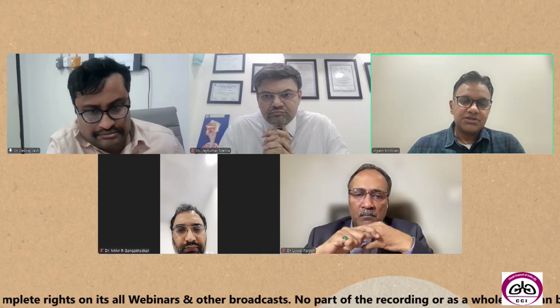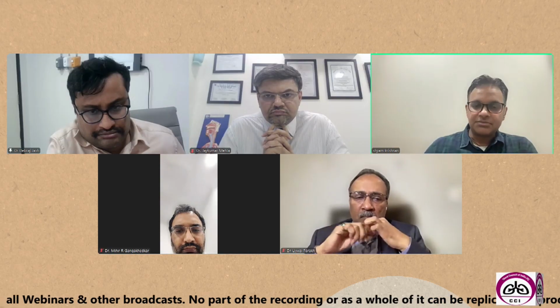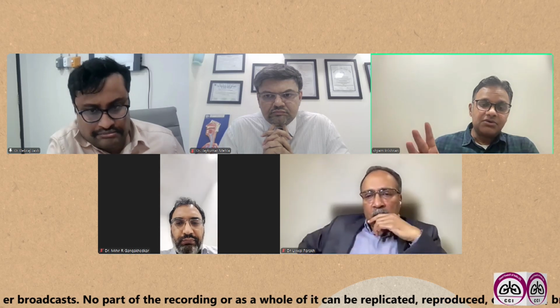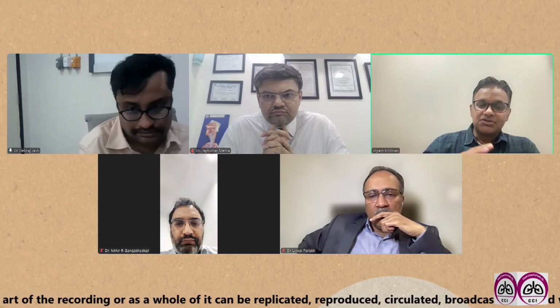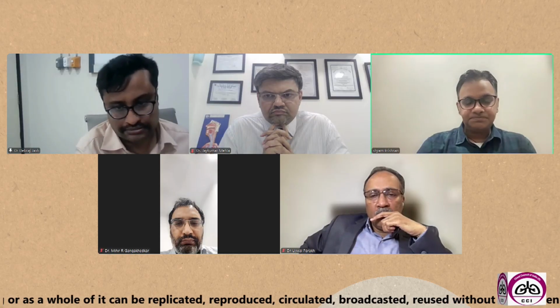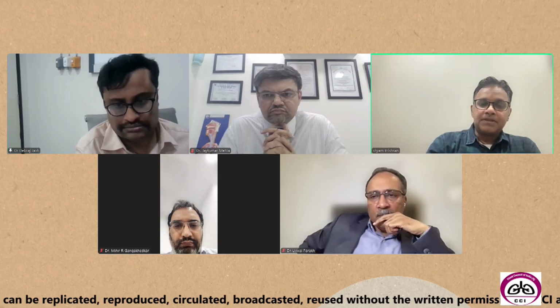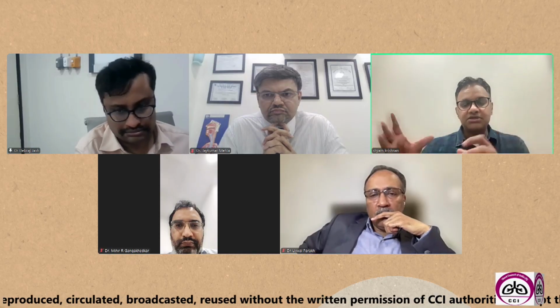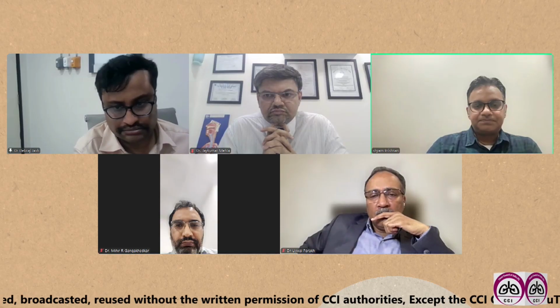The issue with that was, especially during training while teaching students, I learned in Olympus, so I found it comfortable starting with that. But then I find Pentax to be equally good because they have a separate monitor for the endobronchial view and a separate ultrasound. So it's very easy when you get to see the landmarks clearly and you get a very good ultrasound view. Plus it has elastography, which is an added advantage. It occupies more space in the bronchoscopy suite because you need to have two separate stacks. So those are the advantages and disadvantages of Pentax.